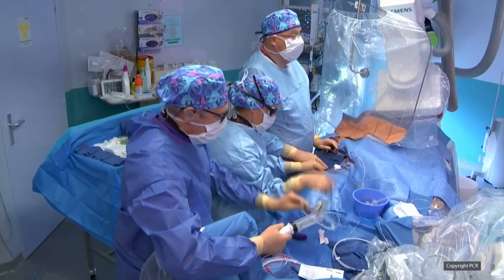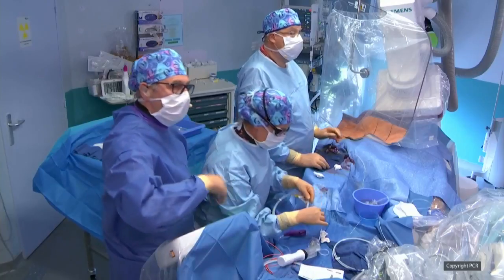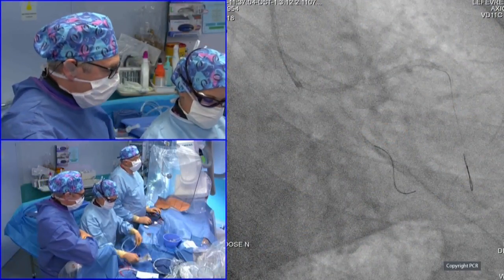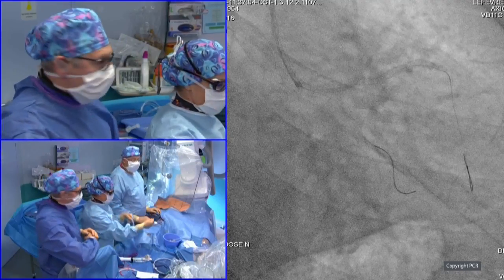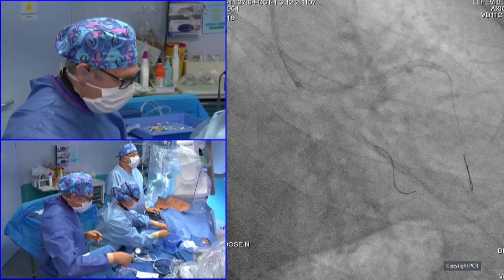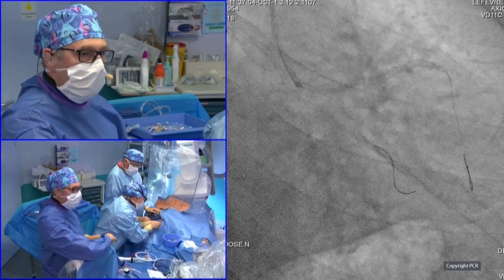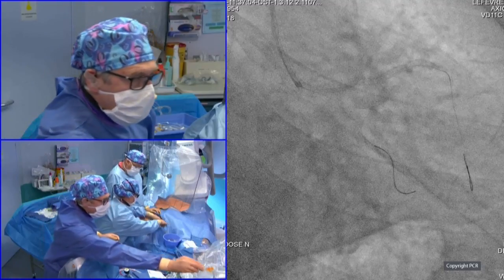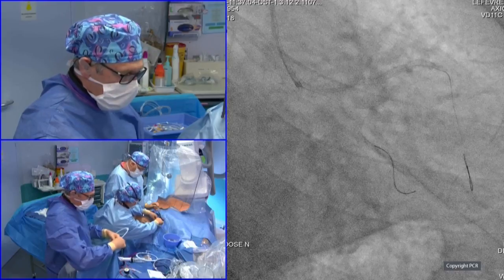So you know this wire crossing is actually very specific. Only one where you want to re-enter into the circumflex. There was some talk, if you're hesitant about how significant an ostial circumflex is after stenting the left main, to FFR it. But I'm just thinking recrossing an FFR wire is not going to be as easy as your workhorse wire, and not as precise. Not as correct. Unfortunately, but we have assist FFR, so it could be very easy to do it also.